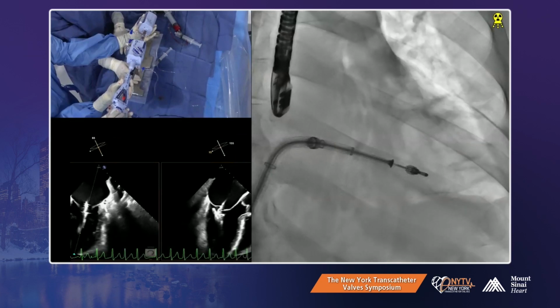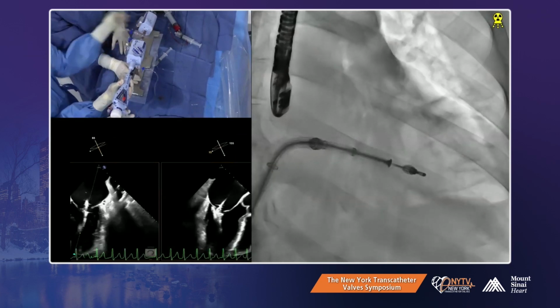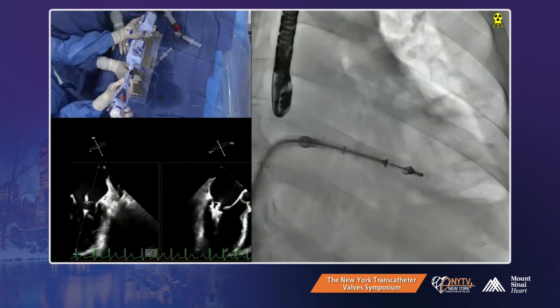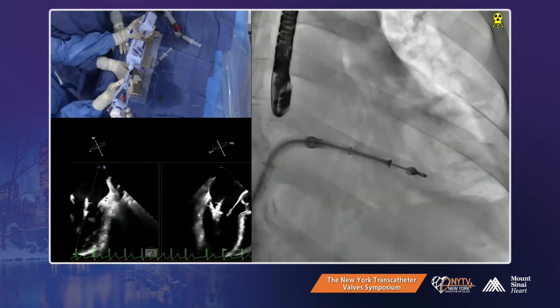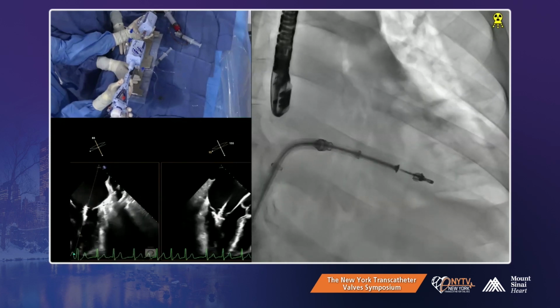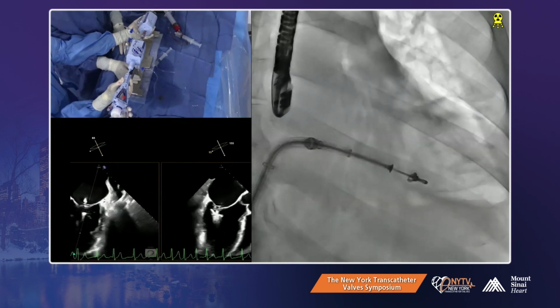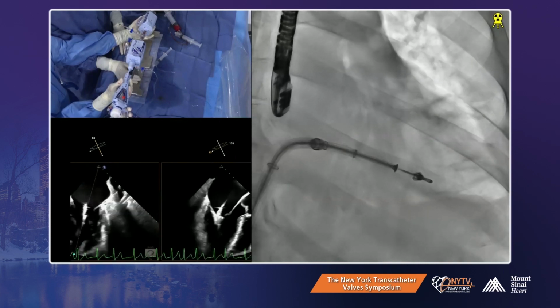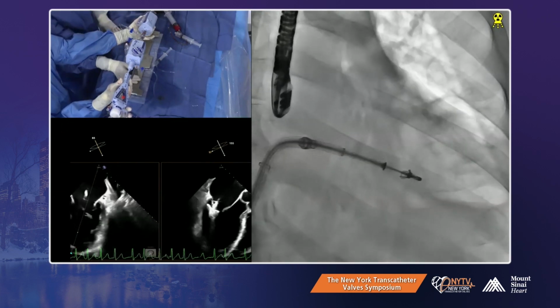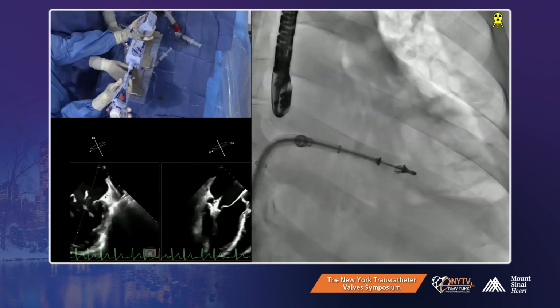That heart rate is very hard to work with. Yeah, posterior nicely. Okay, drop the posterior. Okay, one second. It's very dynamic, right? Did you want to give an esmolol drip? Can we try a smaller esmolol drip? We really need to bring the heart rate down.